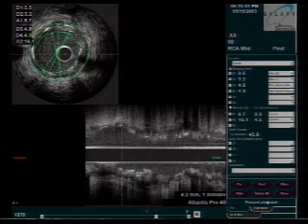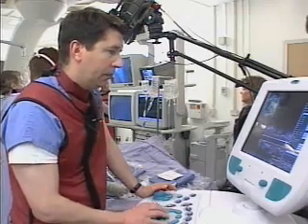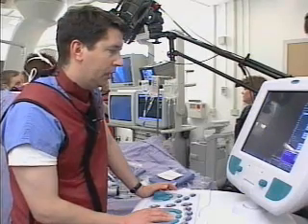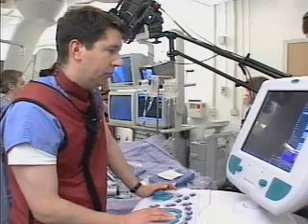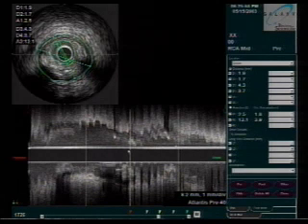So the area has gone from about 2 millimeters squared to almost 9. That's right. Is that correct, Mike? That's right. It was 2.5, I believe. I can just flip back. If we're still live on the full screen IVUS, I'll refresh our memory. This was a pretty tight blockage at 2.5 millimeters squared of cross-sectional area, and now we're at about 8.7. So we've gone up almost by a factor of 3 or 4 in terms of the area of the vessel to carry blood to the heart muscle, which is going to correlate very well with relieving this fellow's symptoms, I believe.